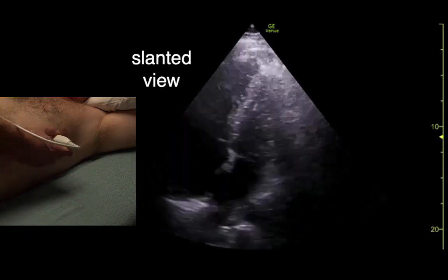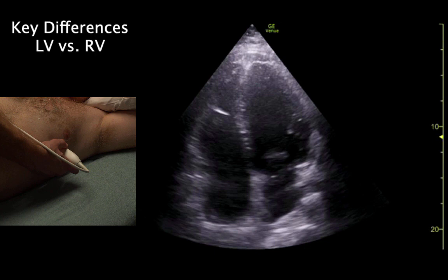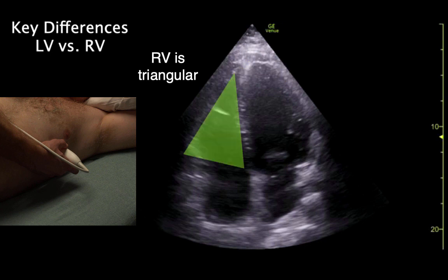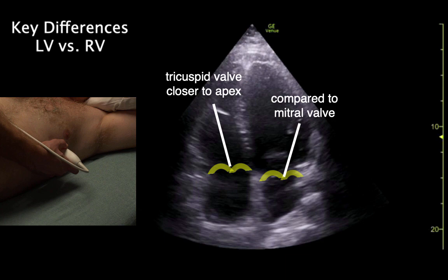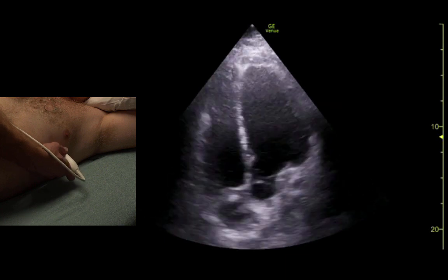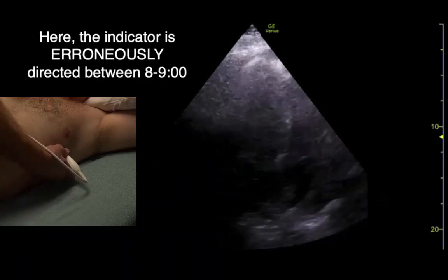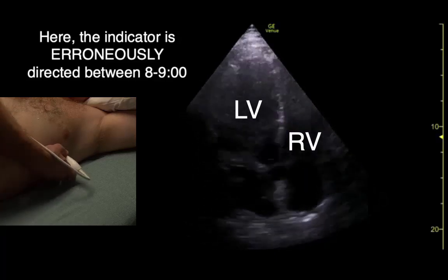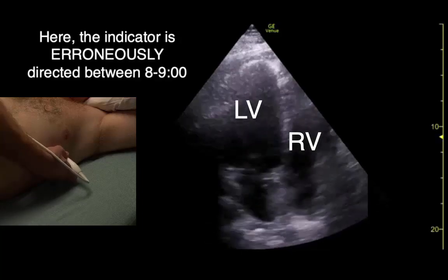If we get a view that's tilted, we need to go out more lateral and straighten it out — we want the septum straight up and down. My hope is that if you accidentally reverse the view and have the ventricles flipped, you'll be able to use the features of the different ventricles and their appearance to troubleshoot, recognize that mistake, and avoid diagnostic errors.